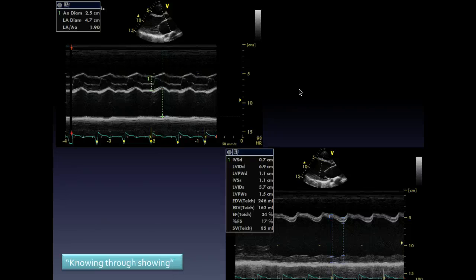This left atrium is big, and this left ventricle is big. But hang on, we got 5.7 centimeters. Didn't I think it was 7? Okay. So the point is, no single technique is going to give you absolutely consistent results. I don't really mind whether it's 6.1 or 6.2. It actually came out at 6.9 on this, right? But it's only a freak that it's anywhere within a few millimeters. And I'll be honest about it, you'll keep measuring until you get the same answers. Human nature is to round it out. But this is a big heart.